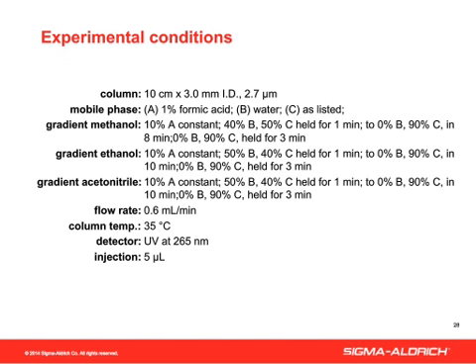Temperature and flow rates were kept constant throughout the assays. The initial screening was conducted using a UV detector, with the ultimate goal of moving this into a mass spec assay. We felt it was a little bit easier since these compounds have great chromophores on them. We won't have a problem seeing them by UV. We weren't going to tie up our mass spec instrument just doing initial screening for this.